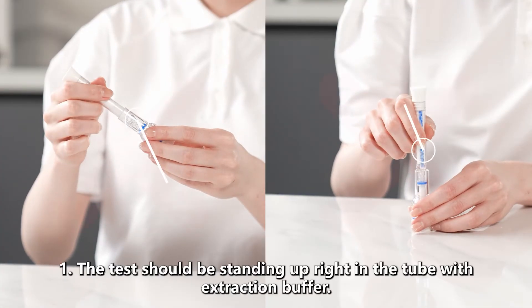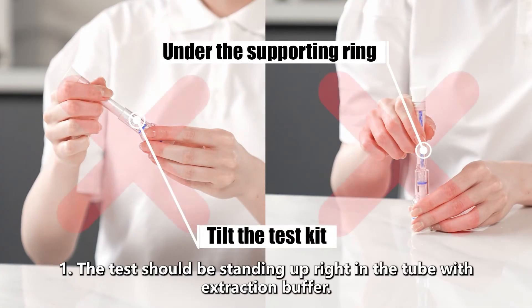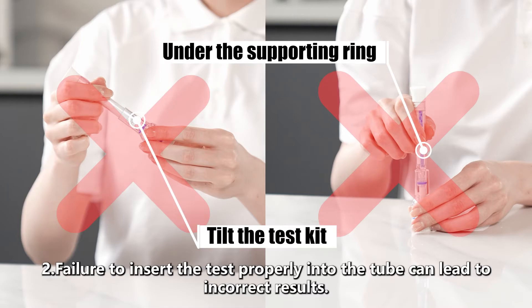Attention. 1. The test should be standing upright in the tube with extraction buffer. 2. Failure to insert the test properly into the tube can lead to incorrect results.